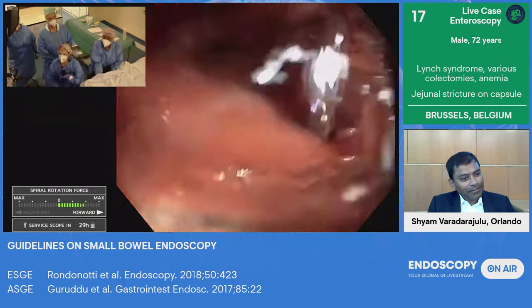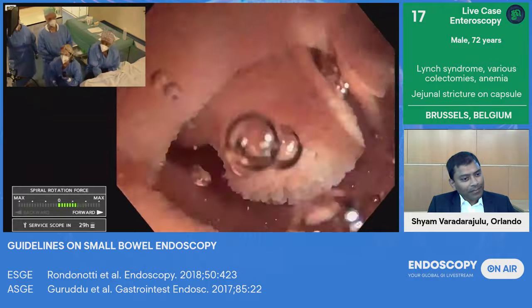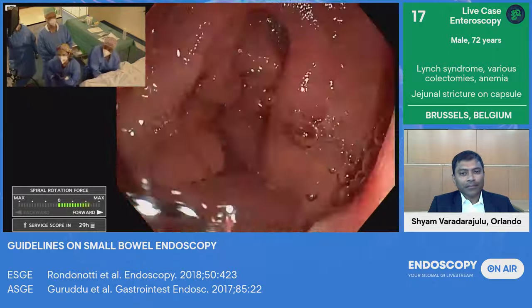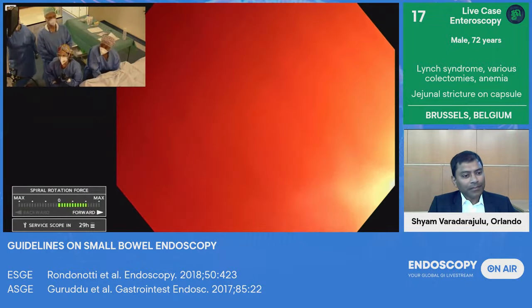Maybe this is the time when we have to pull back a little bit the scope while maintaining the forward motion.